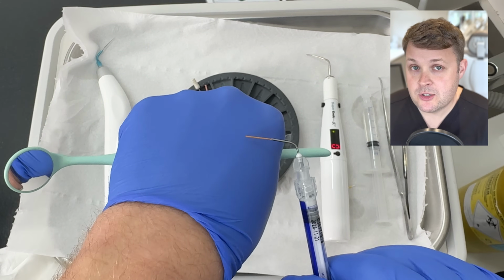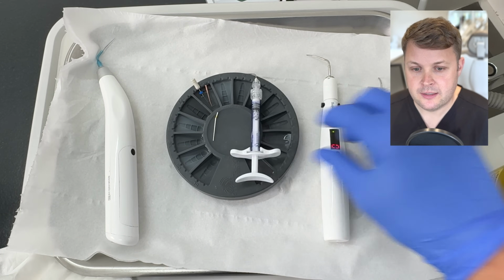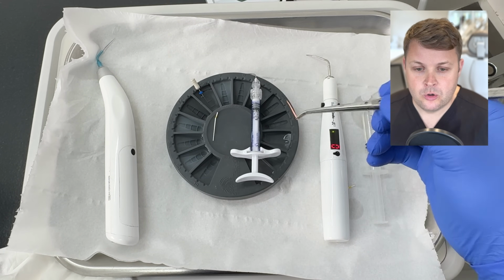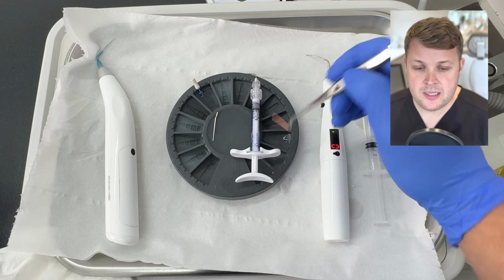So we're ready to set up for our obturation. I'm measuring the Bioceramic. I'm using one fill here to almost maybe 2 millimeters away from the working length. I'm going to pick up the GP cone.